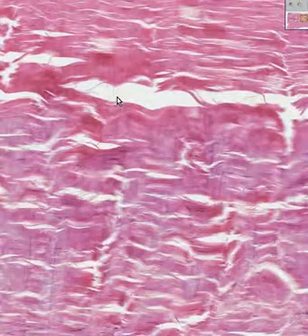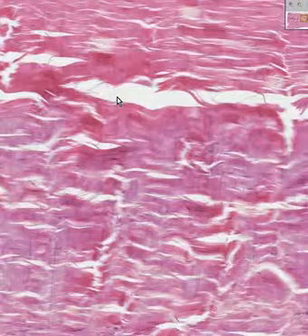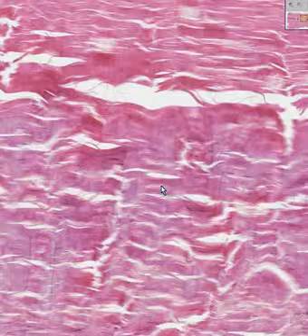Here we probably see a blood vessel running through it. So these cells here are probably having some relationship to the edge of a blood vessel, which we're cutting. Also notice, because this connective tissue is very, very dense, you're more likely to get these little open spaces, these irregular jagged spaces. And these are simply artifacts due to the fact that we are cutting more dense, more brittle connective tissue. So you're more likely to see this type of cutting artifact in dense, regular connective tissue, in other words, tendon, than we are in loose, irregular connective tissue.